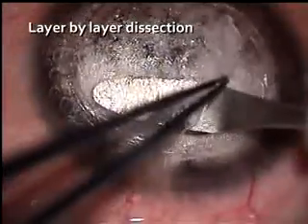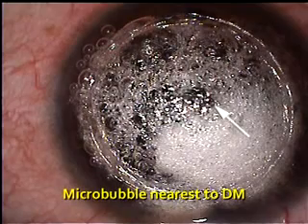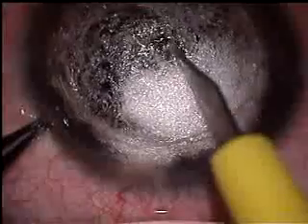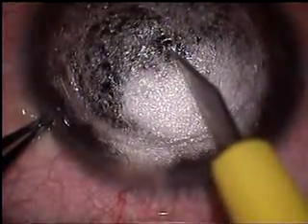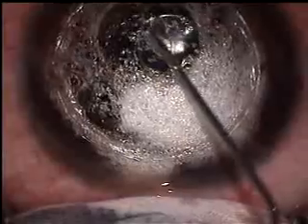Layer by layer dissection was carried out. Microbubble nearest to Descemet identified. Punctured. Viscoelastic injected to detach Descemet from rest of the stroma.